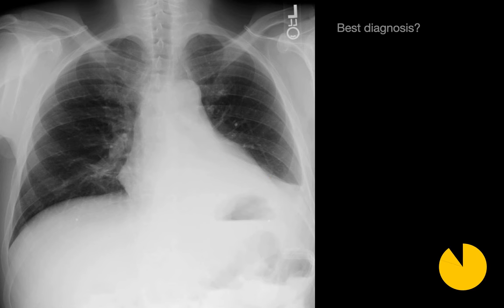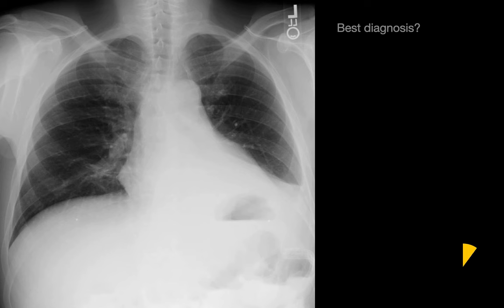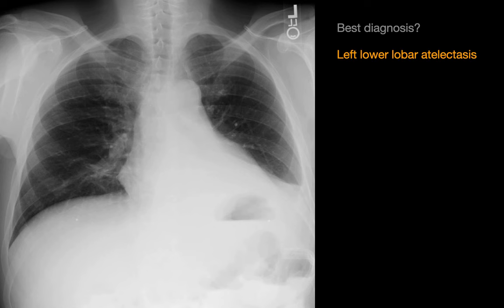What is your best diagnosis? When you see a flat waist sign, the best diagnosis to think of is left lower lobar atelectasis.